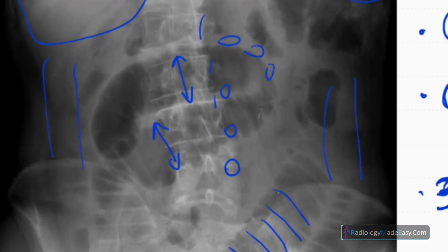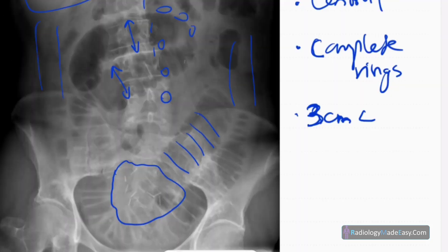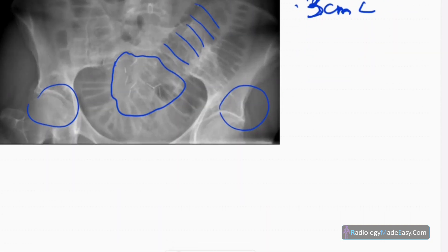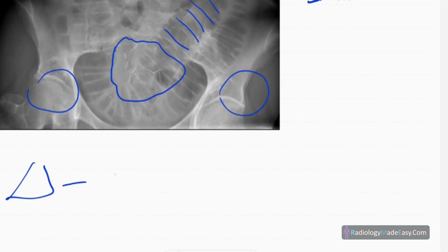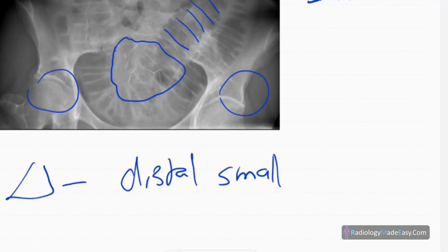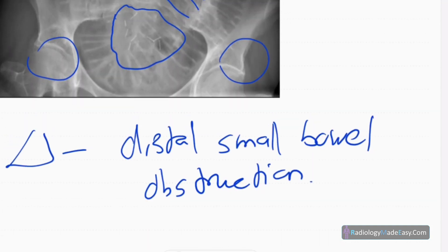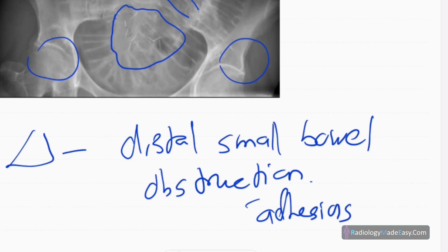There are no obvious hernias in the inguinal region, which can also cause this appearance. In this case, the diagnosis is distal small bowel obstruction, caused by previous surgery — specifically, adhesions are the cause.